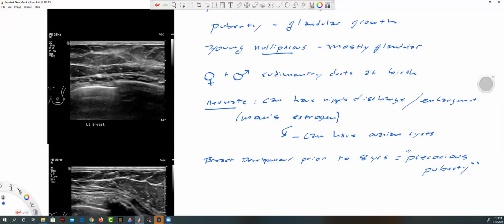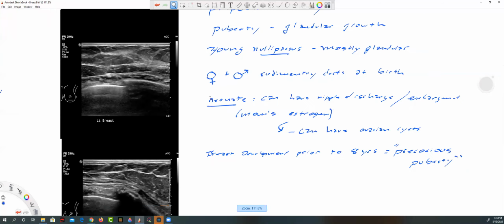So what do I want to do? All right, let's get away from writing stuff. Let's look at other images we have. I got a whole line. I didn't realize how many pictures there were until I look at that.